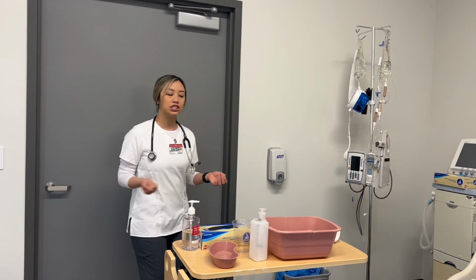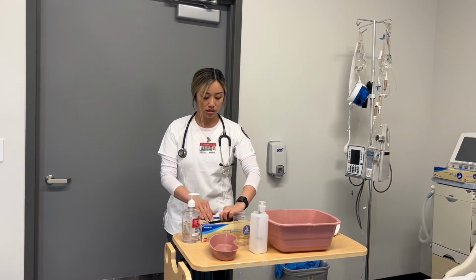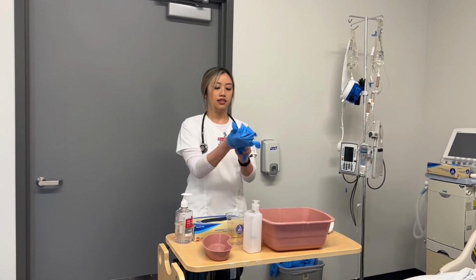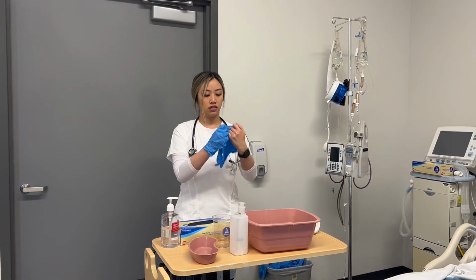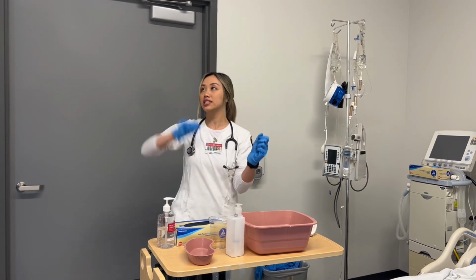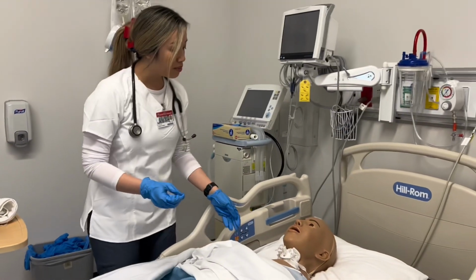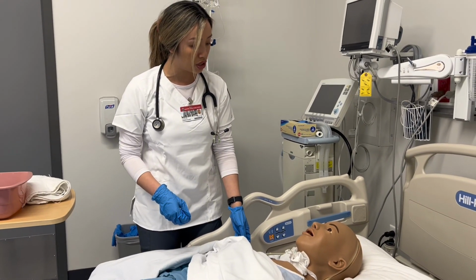So I'm going to enter the room. I'm going to perform hand hygiene. And I'll perform some privacy and introduce myself. Hi sir, my name is Alicia. I'm your nurse today. I'm going to place an NG tube.